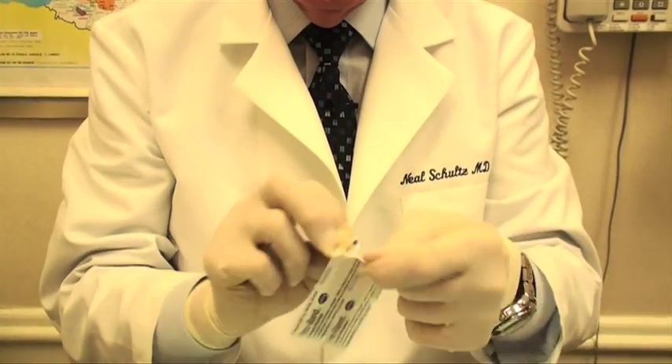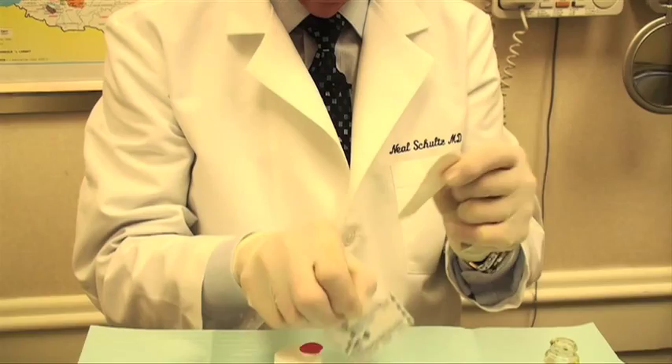Then, of course, a band-aid is in order with some topical antibiotic ointment — a regular band-aid on the area that's been removed. It's best to promote healing with an antibiotic ointment and band-aid applied three to four times a day for a period of a week to two weeks.